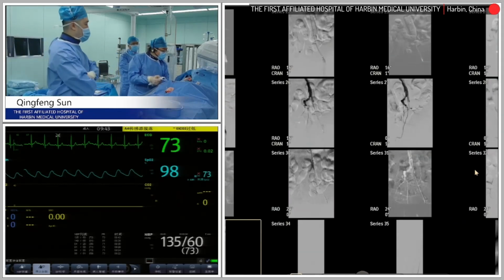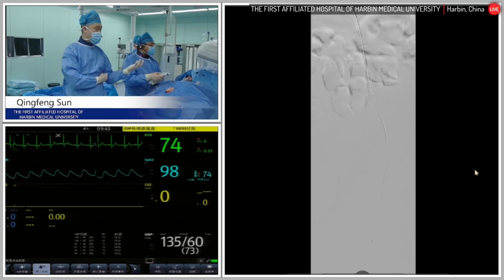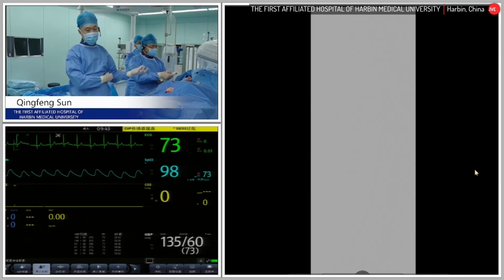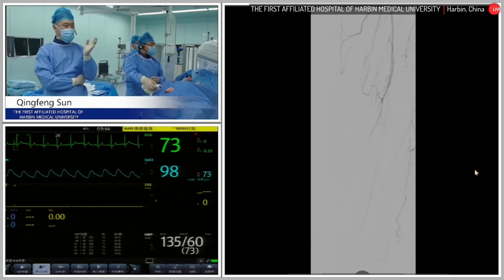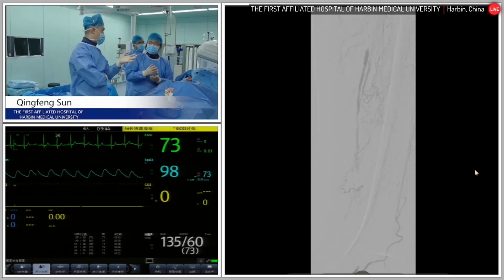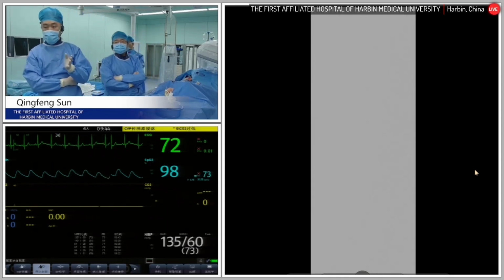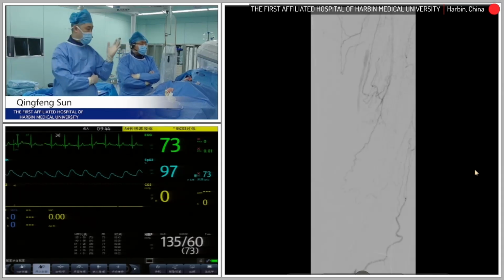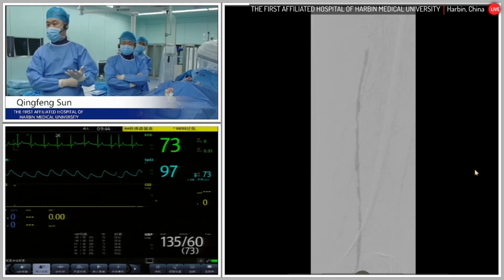Based on our experience, opening the proximal arteries can definitely relieve the symptoms. But if the patient has Rutherford 5 or 6, with gangrene or ulcer on the foot, we definitely recommend opening the iliac artery and SFA, because it will help the healing.